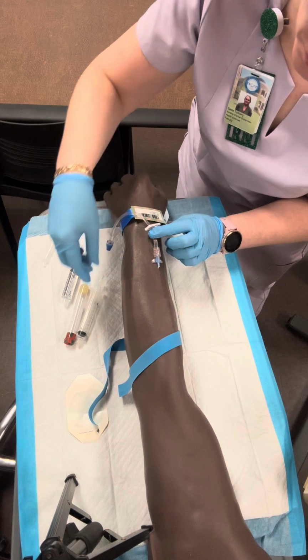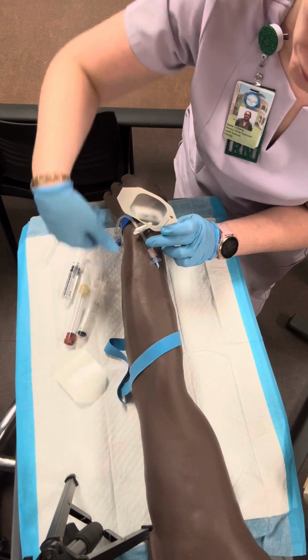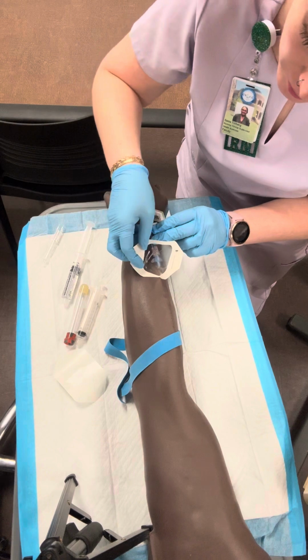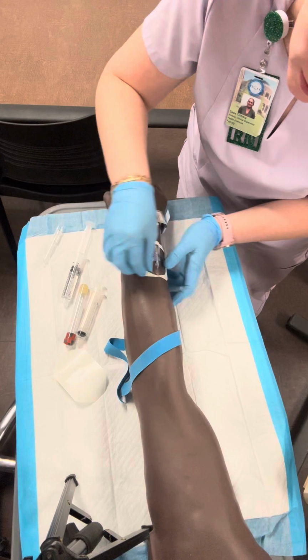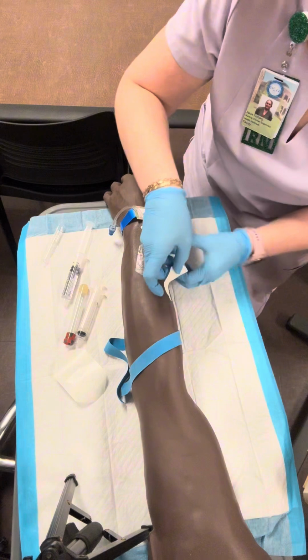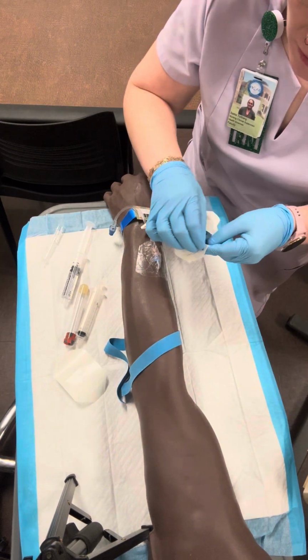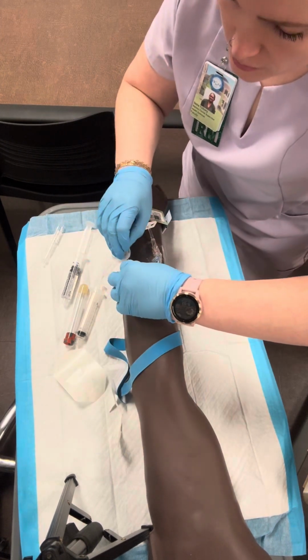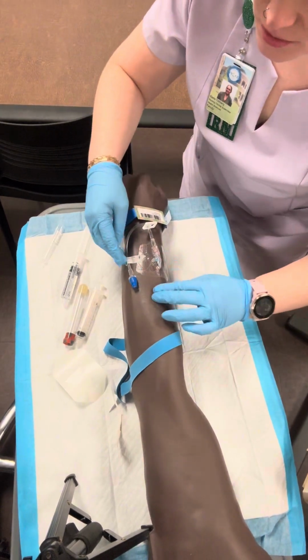And I'm going to grab my Tegaderm. Place it, securing it best as I can. Around. And I'm going to take this extra piece right here to loop it up. Make sure it's all on.